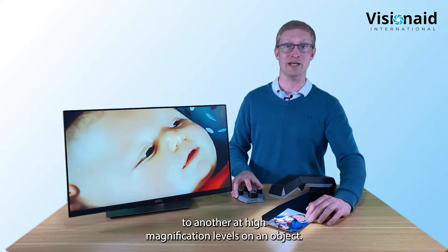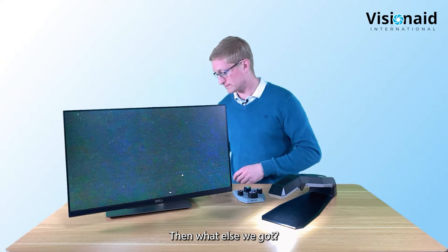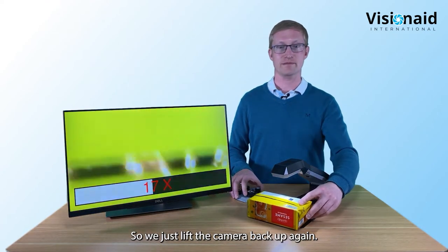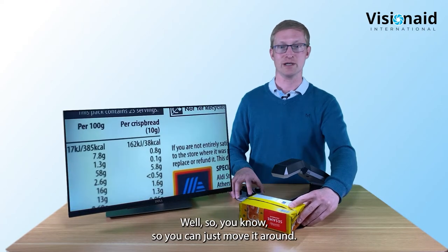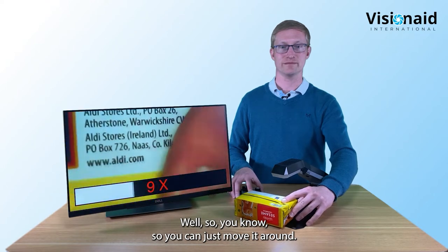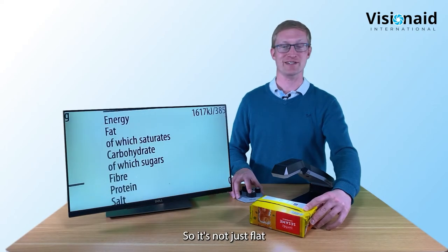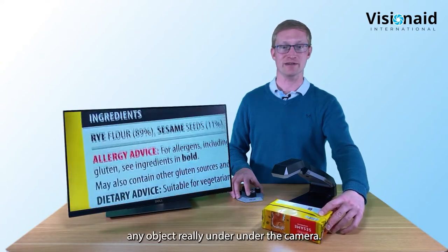For thicker items like food packaging, you lift the camera back up again. You can move the item around underneath - it's not just flat printed sheets you can read, you can magnify any object under the camera.